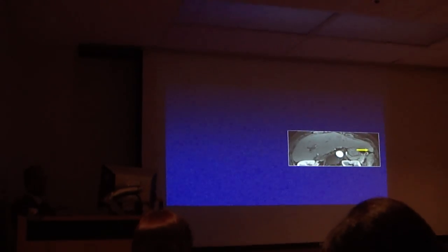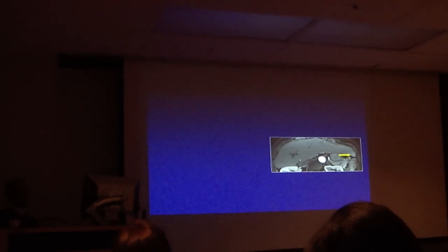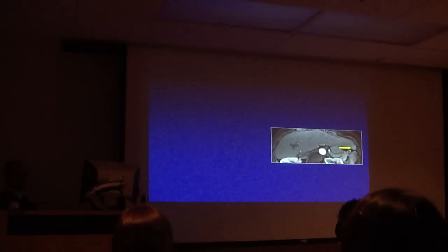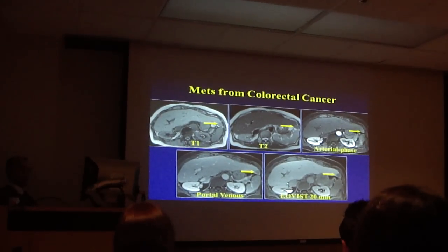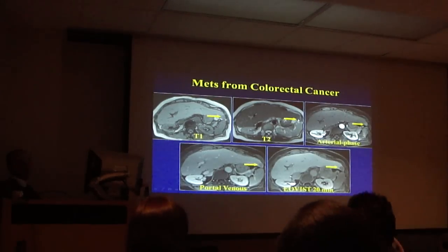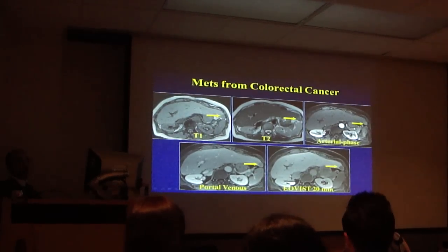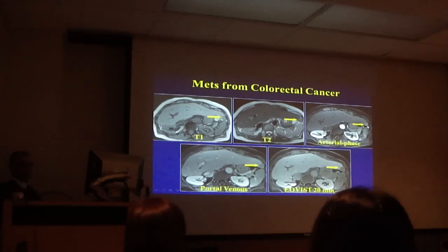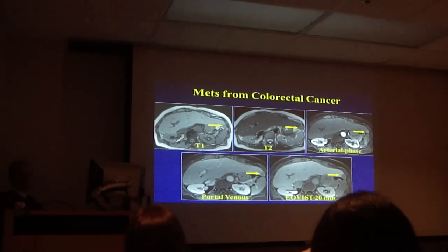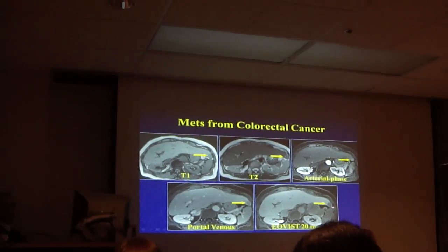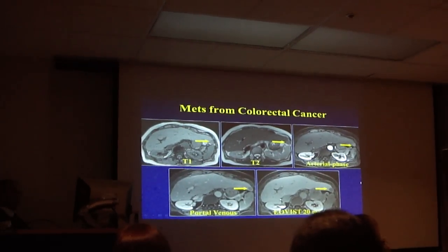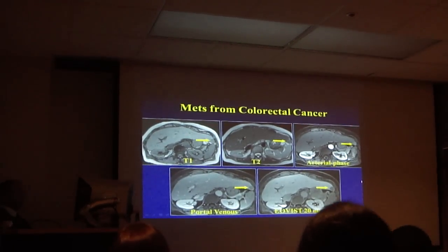Next lesion. On T1-weighted images you can see the lesion hypo-intense. On T2-weighted images it is sort of subtle, hyper-intense. On arterial phase it definitely enhances. On the portal venous phase it washes out. On EOB 20-minute delayed images, it does not take up EOB. So it is a worrisome lesion. The patient actually had colorectal cancer and this was metastatic disease — pathology proven.